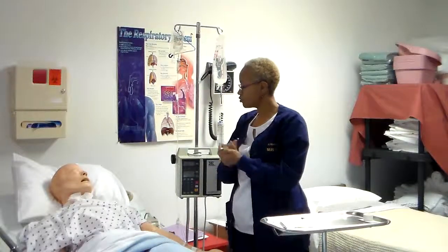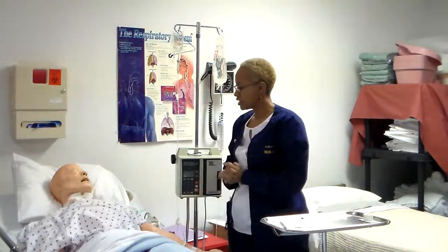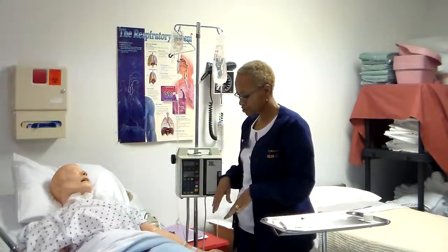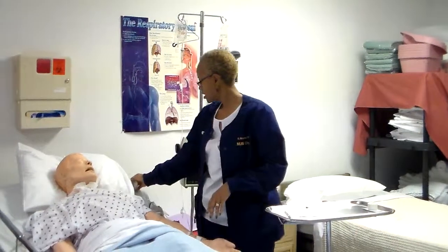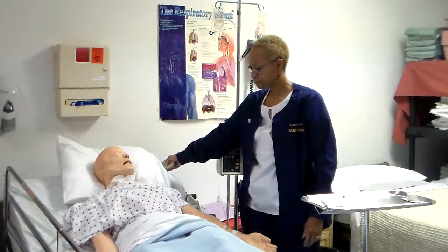Okay, please let me know. Put on your light if you have any burning, any irritation, even if the arm feels cool at all. We want to make sure it's not infusing into the tissues. And so just let me know. Put on your light so we can come right in and check that right away for you. I'm going to lower you back down.